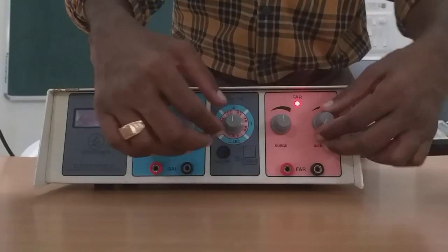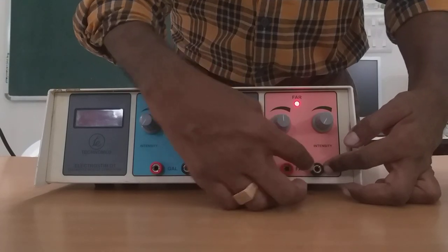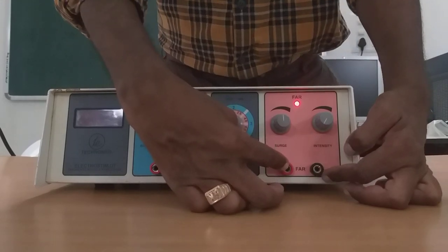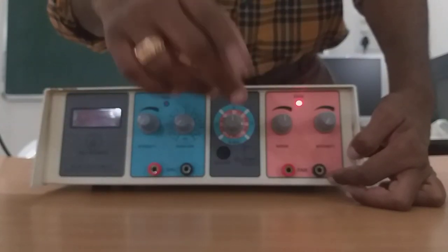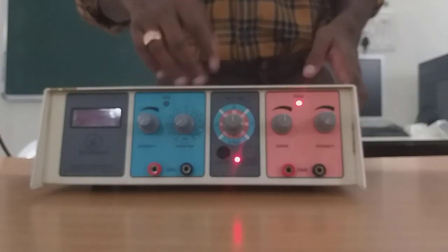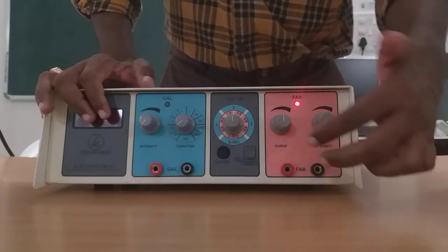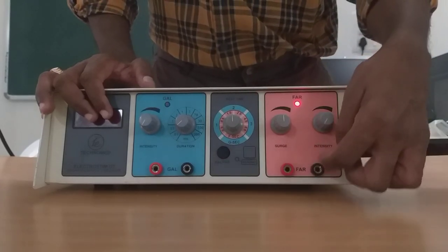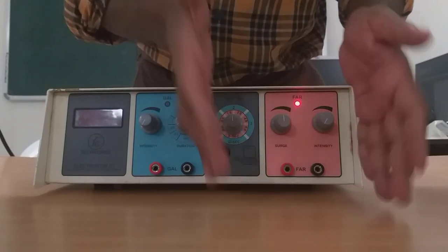Beneath that you can see the output. This is the output and you all know it is black and red. Black is universally cathode and red is universally anode. But this machine is different — here red is cathode and black is anode. I will tell you how to test this also. So remember: in this machine red is cathode and black is anode. I will explain more about this in the next sessions.